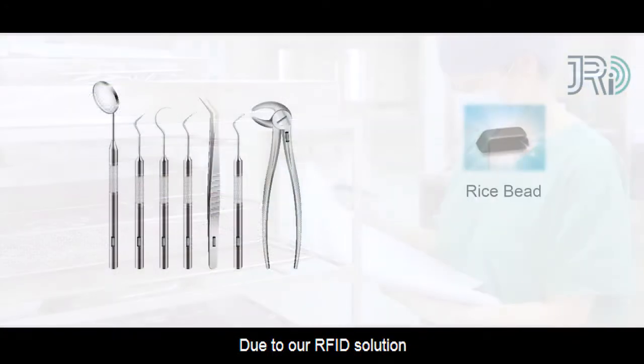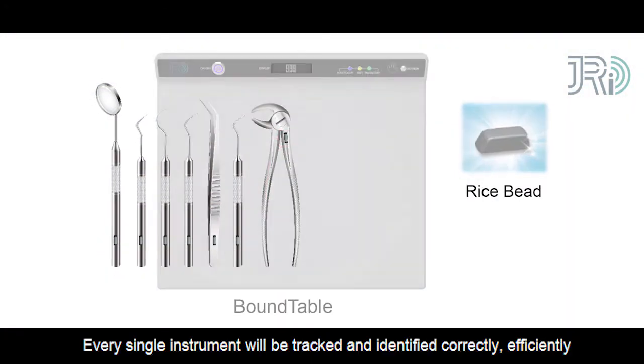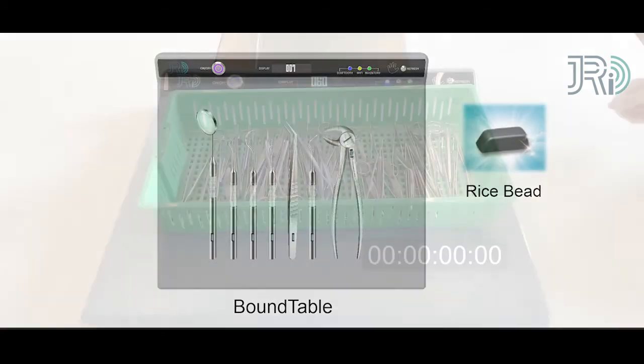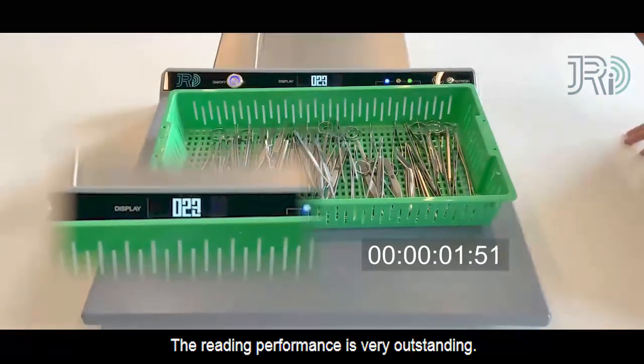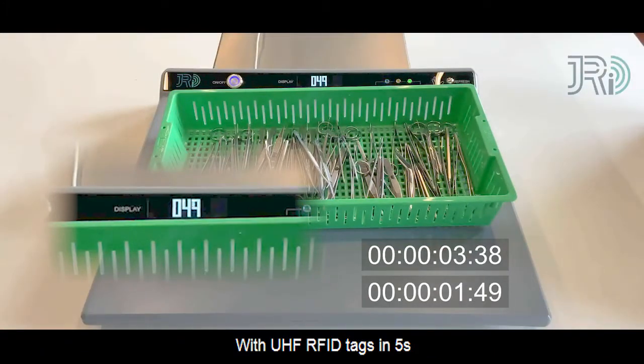Due to our RFID solution, every single instrument will be checked and identified correctly and efficiently. The reading performance is very outstanding — it reads up to 60 surgical instruments with UHF RFID tags in 5 seconds.